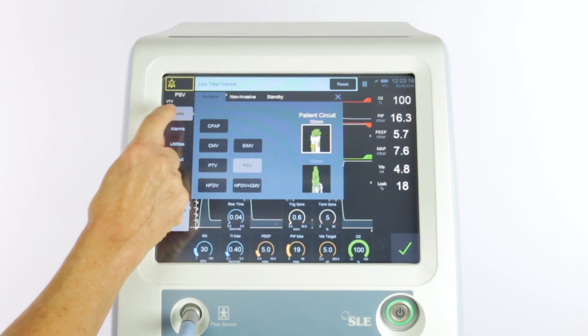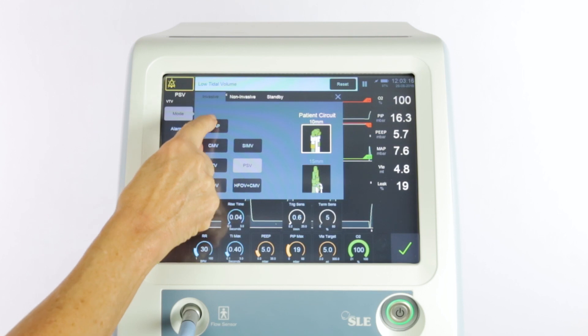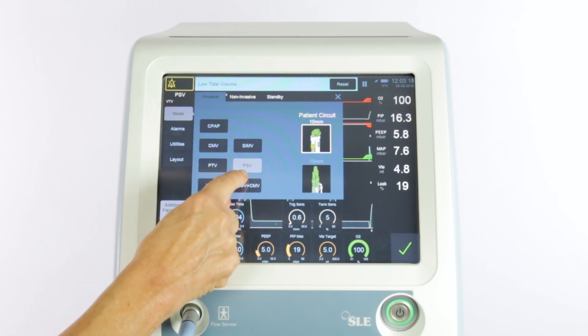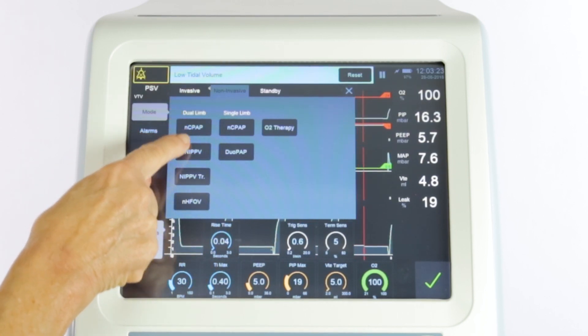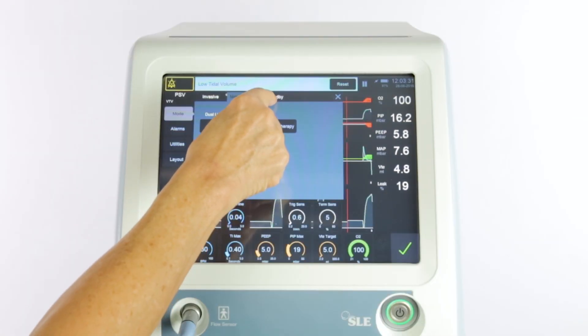Selecting it opens up a menu showing invasive ventilation modes. Using a series of tabs along the top, you can switch between pages showing other modes such as non-invasive and standby.